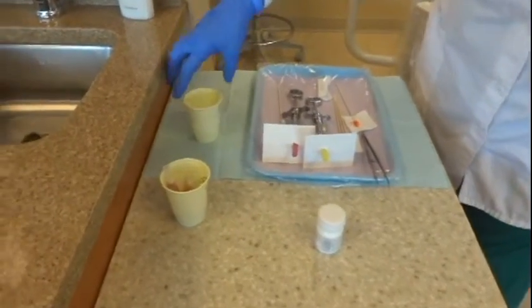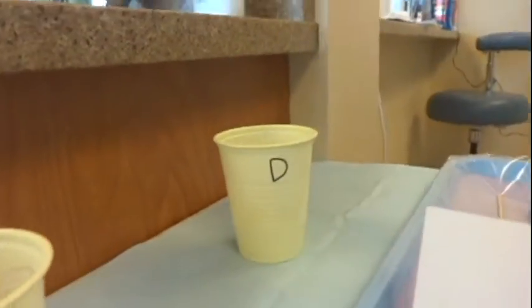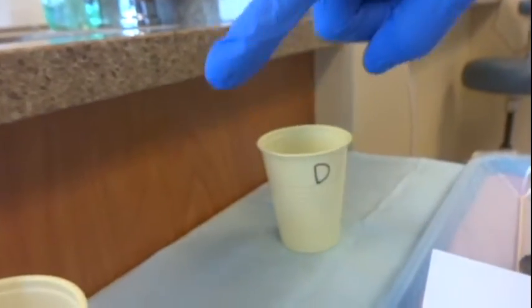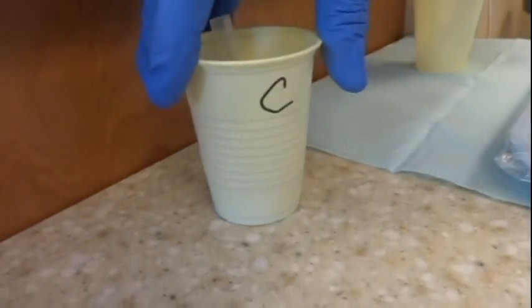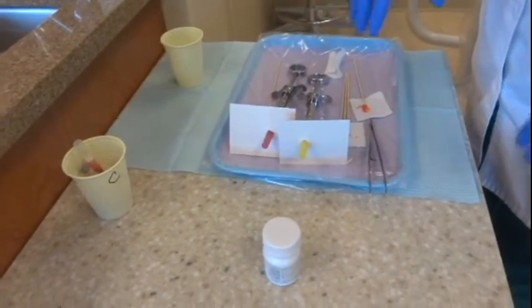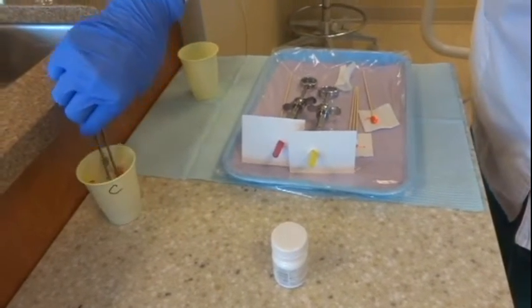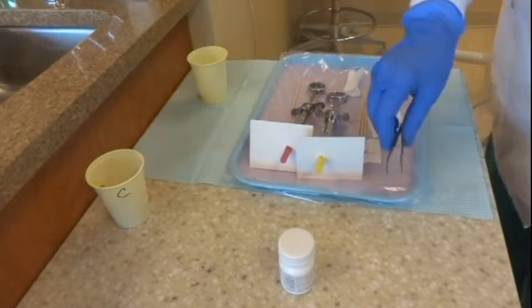We have two cups marked D and C — D for dirty, C for clean. You want to keep the dirty one on the dirty side and the clean one on the clean side. Don't accidentally put the clean one over on the dirty side. You also want to make sure you've got extra needles and extra cartridges — you don't want to have to dig in the drawer if you need to give a little more anesthetic than you thought. You can just grab it with your cotton pliers and it's remained clean. If you don't use them, you can put them back in the drawer.